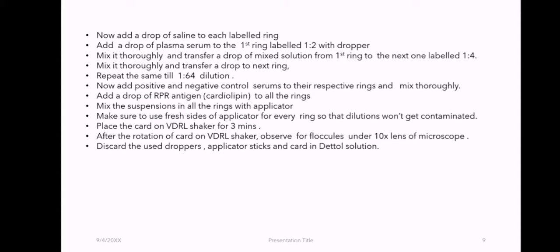Add positive and negative control serums to their respective rings and mix thoroughly. Add a drop of RPR antigen to all rings and mix the suspensions with an applicator stick, using a fresh side for every ring to avoid contamination. Place the card on the VDRL shaker for 3 minutes. After rotation, observe for floccules under the 10x lens of a microscope. Discard used droppers, applicator sticks, and the card in Dettol solution.